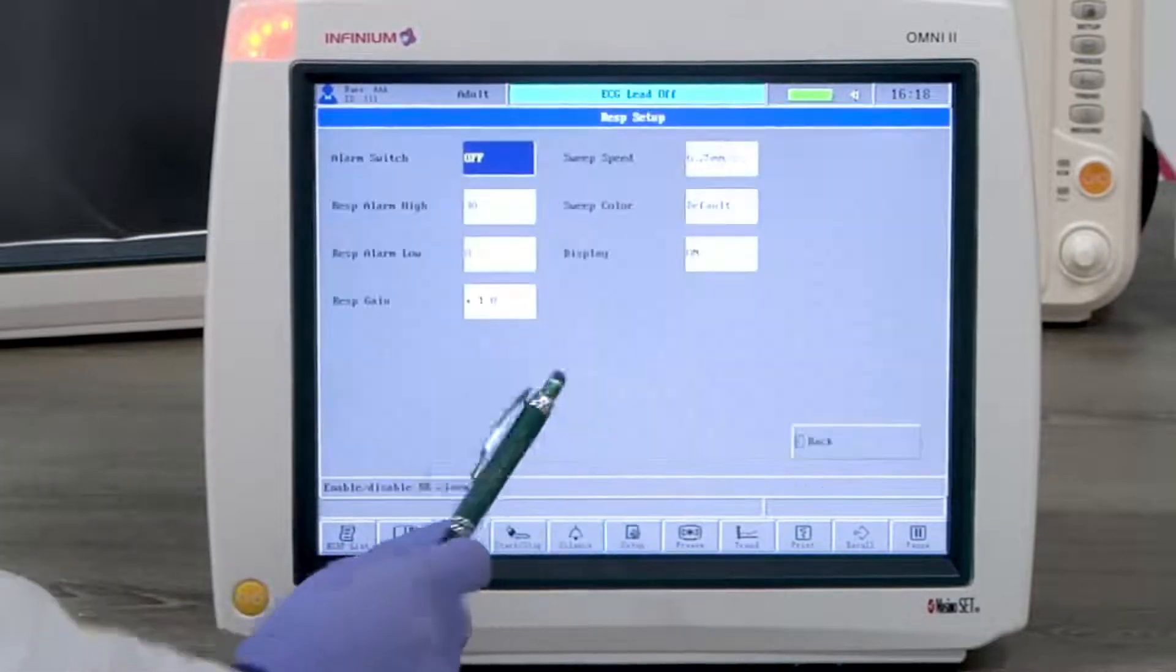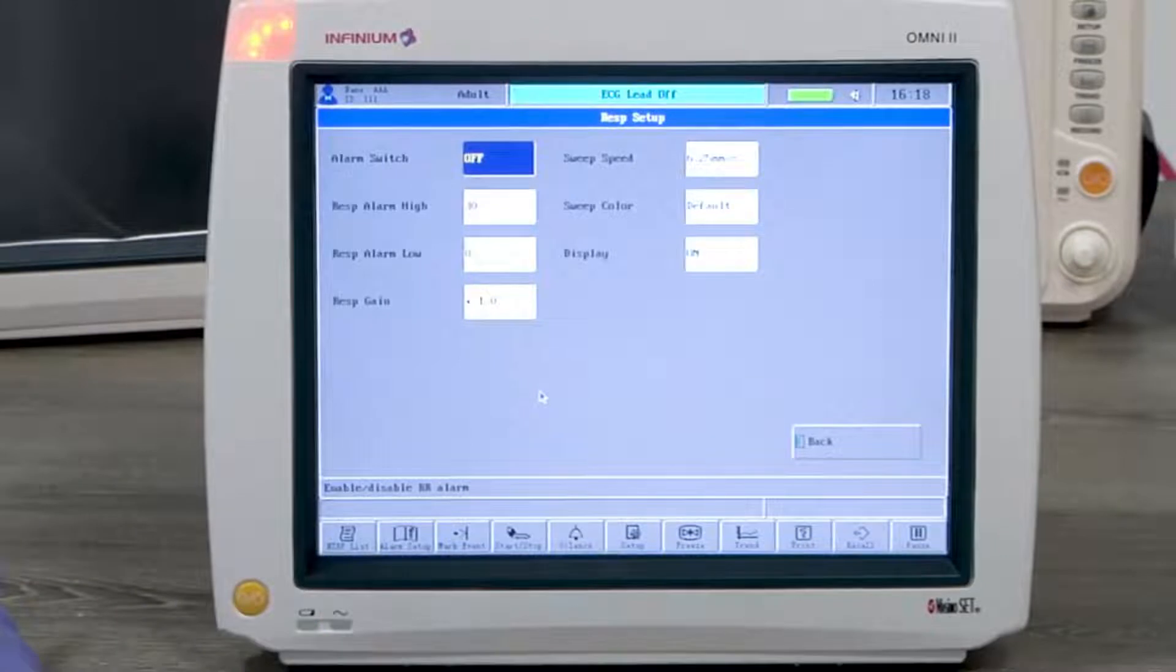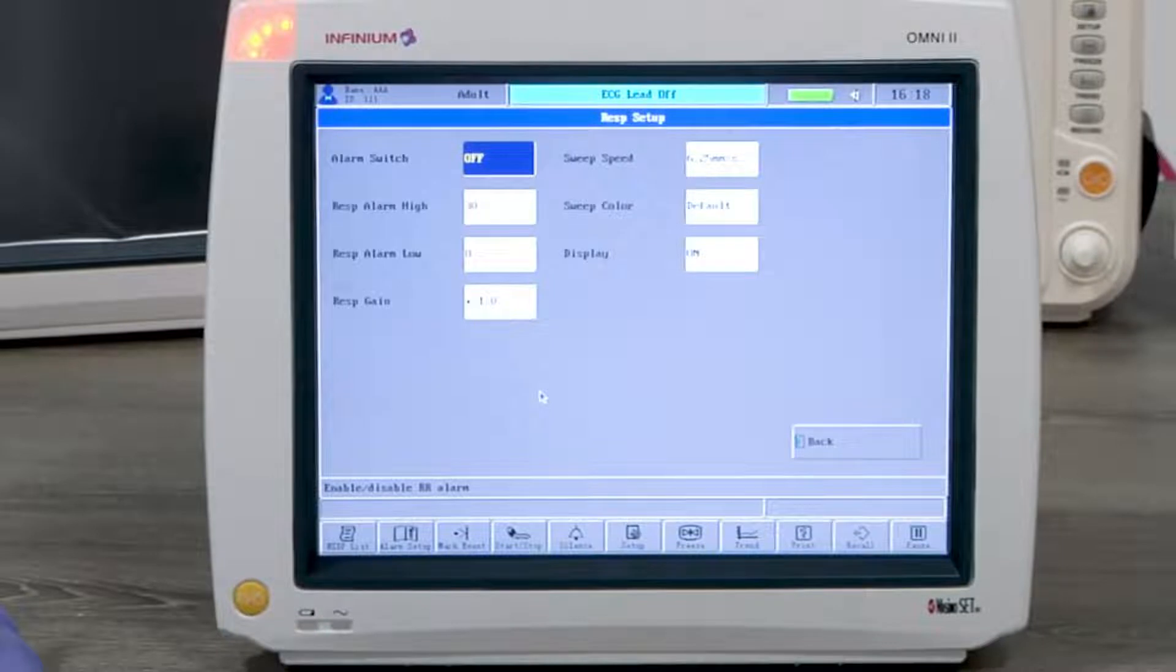Respiration is derived from ECG. Tapping on the resp waveform or resp reading window will enter the resp setup menu. This setting can be changed according to the user's preference.